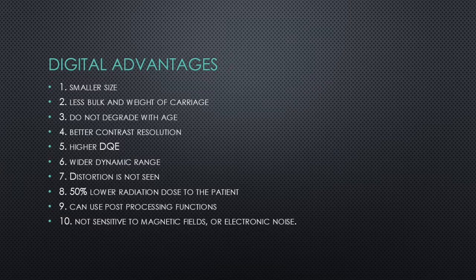The rectangular and flat shape of the flat panel removes that vignette distortion seen with image intensifiers. And again, the dose is lower because of the pulsed beam, meaning the X-ray is on and off in a frame-like sequence using higher mA. Magnetic steering of catheters is now made possible with flat panel detectors because they are less sensitive to magnetic flux or fields. This is a really new technology that uses a magnetic tipped catheter to move through tortuous vessels while a magnetic flux is applied. So this also will reduce radiation doses in the future.